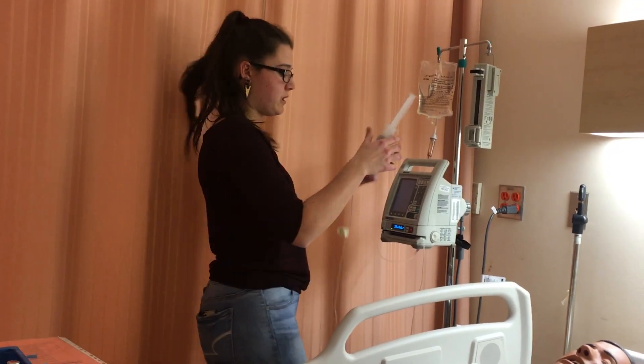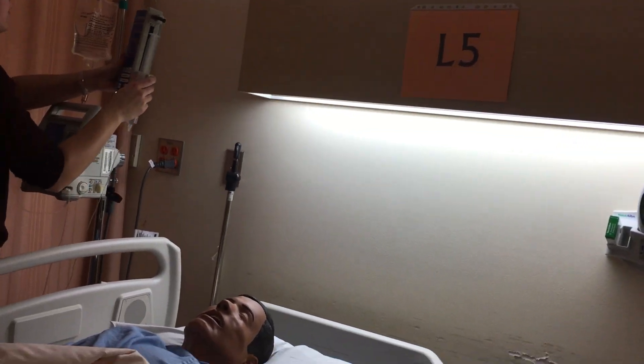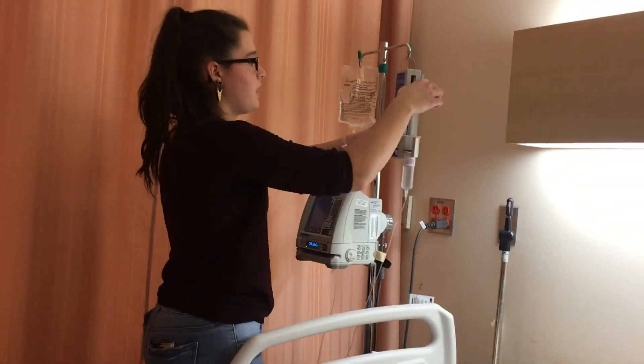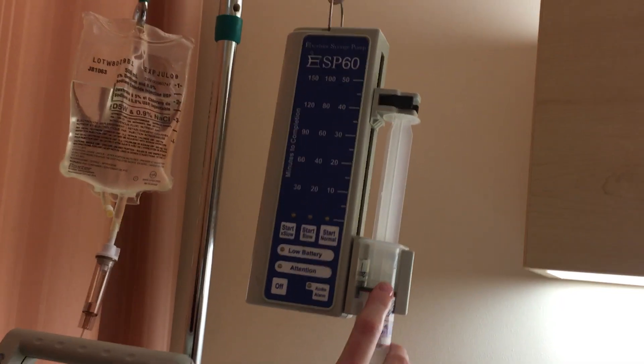All the clamps are open and I can attach my syringe — it's on there properly. I'll lower the clamp for my line and press start. I'll see three little blinks confirming it's running. That's perfect.